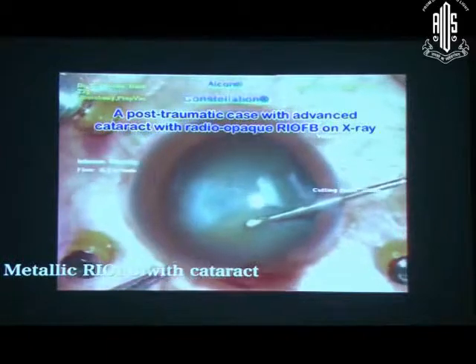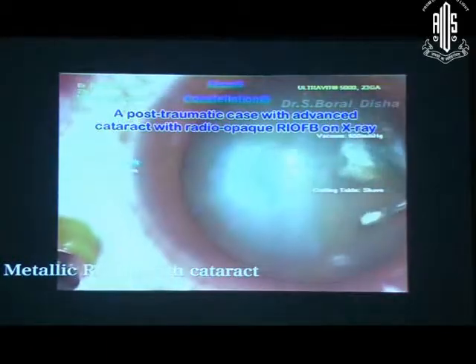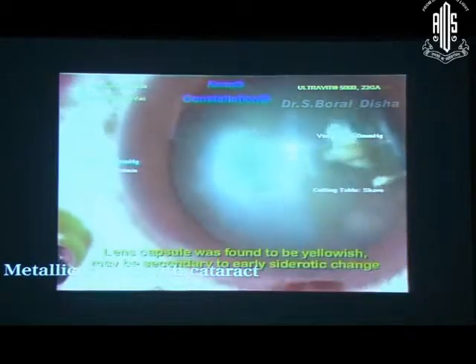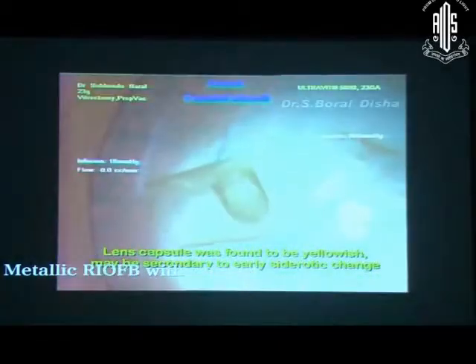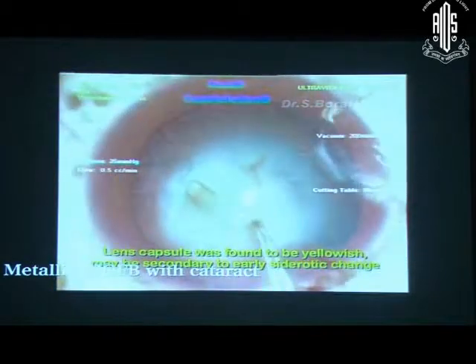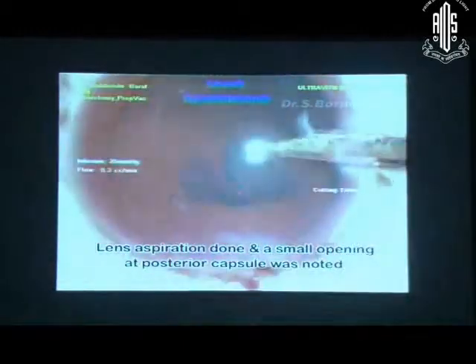Now it is the case of a phakic case with cataract. The capsule is siderosed — that means there are early siderosis changes. So you have to do phacoemulsification. The lens was very soft, so I did lens aspiration only. After aspirating all the lens matter, I found there is a small rent — a small opening.